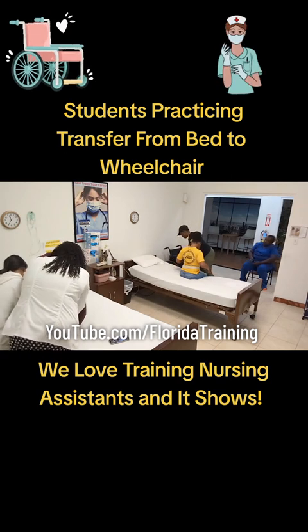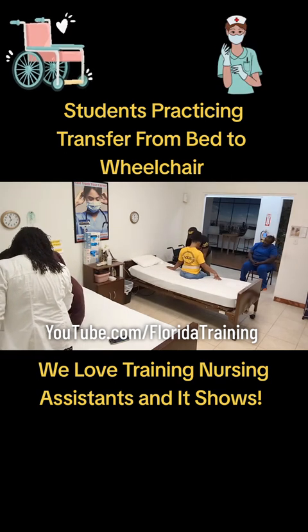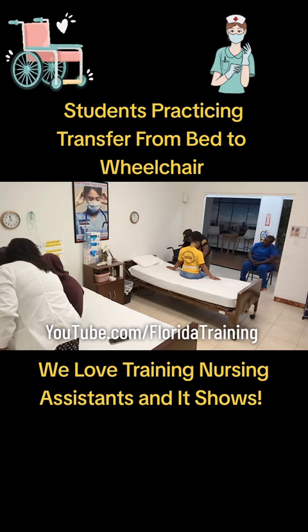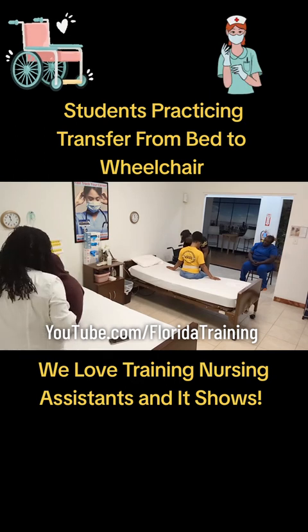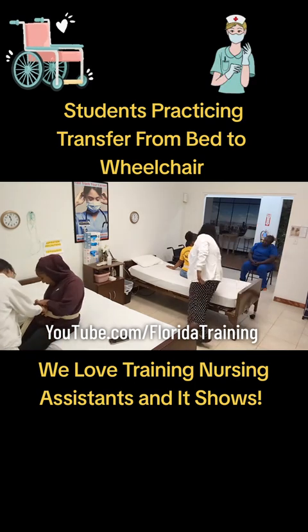Put it down around the waist. Since the teeth are going this way, you're going to take two fingers on the inside, hold the buckle, bring this hand closer, pull away like you're wrapping around. Pull — you have to pick her up. There we go. Look at my CNA touching that belt again — I'm going to pull it tight like that.